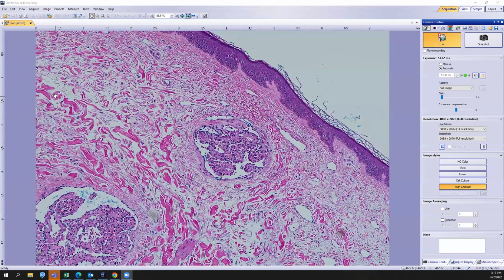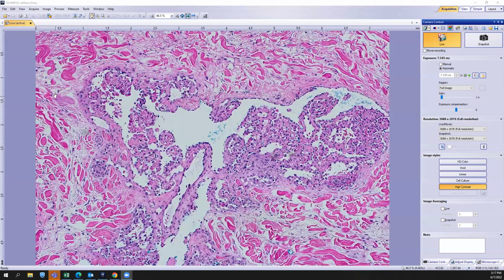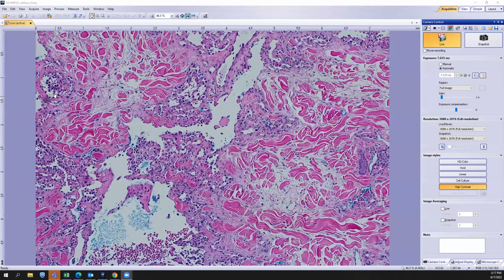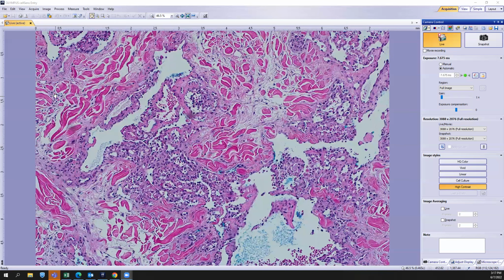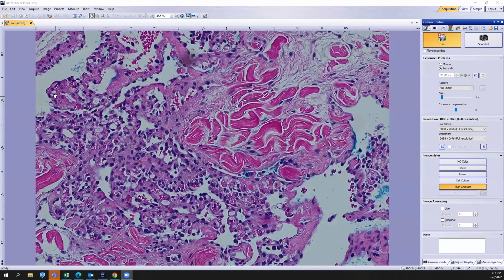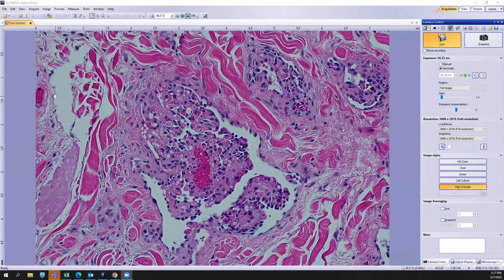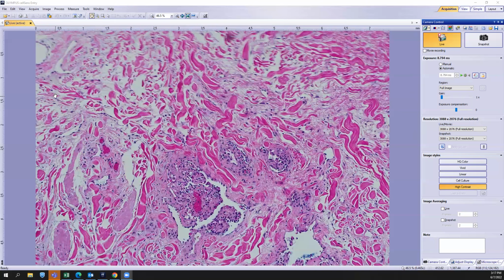There is a related entity that looks very similar, called a papillary hemangioma. And there's a little bit of a debate in the literature as to whether or not these are related or they're completely separate entities. Depends on which paper you read. I will say that the eosinophilic droplets have been cited in both the papillary hemangiomas and the glomeruloid hemangiomas. I think that the most important thing for you to know is that when you say glomeruloid hemangioma, you often trigger the association of POEMS syndrome.